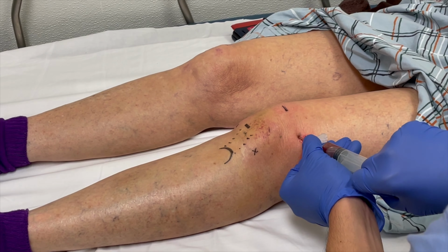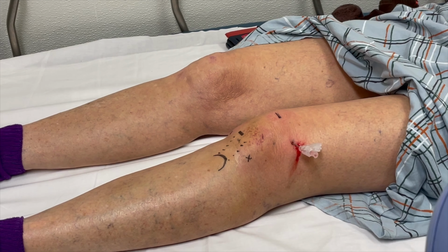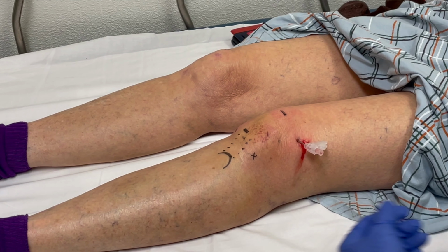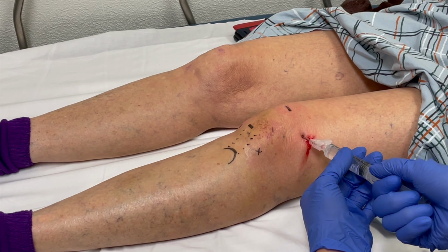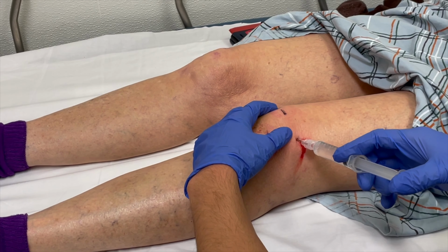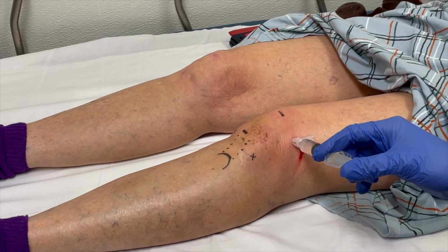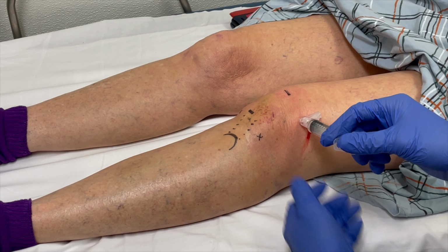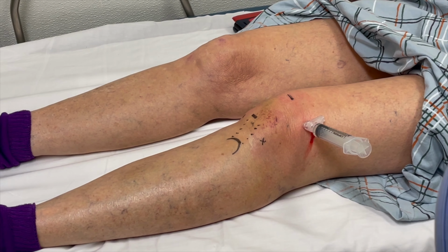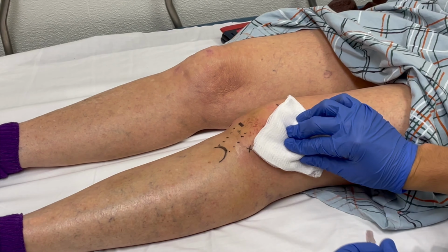Detach the aspiration syringe while leaving the 18-gauge needle in the knee joint, and then attach the remaining lidocaine from the skin anesthetizing to the 18-gauge needle, and inject the remaining lidocaine into the knee joint for analgesia. The aspirate can then be injected into the appropriate collection containers to be sent for appropriate diagnostic studies. Withdraw the needle and compress the aspiration site.